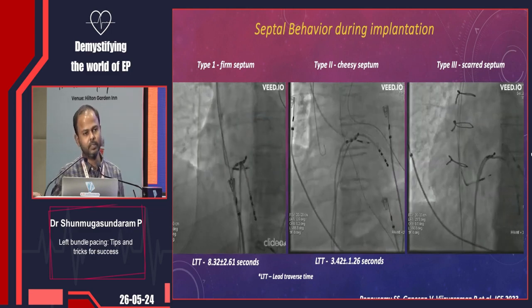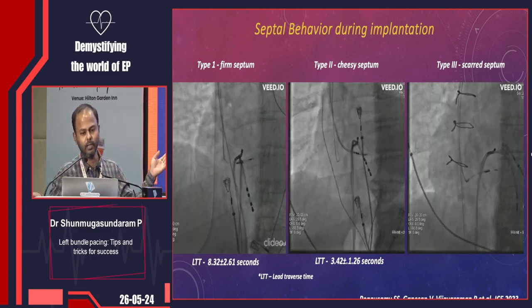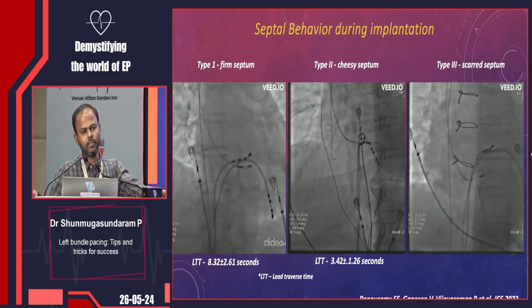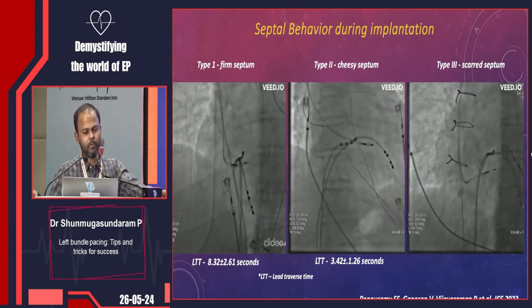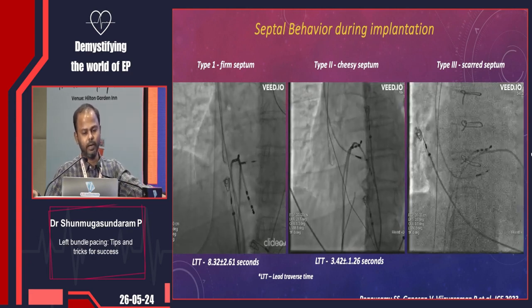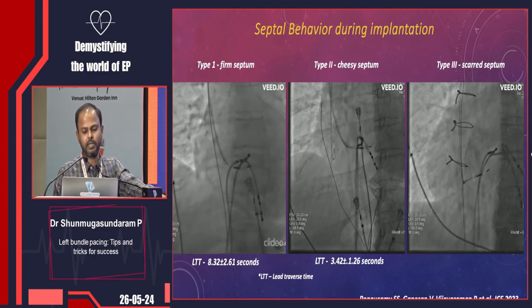This is often seen in patients with normal myocardium, and this predominantly, almost 9 patients we had, which was around 3.5%. Predominantly, these patients had AV block and sick sinus syndrome as their etiology. You can see just a couple of rotations, the lead was just crossing across the septum, landing up into the LV cavity because of the altered texture of the septum.